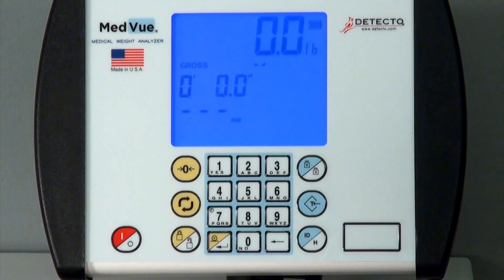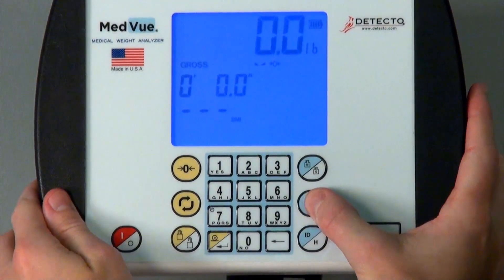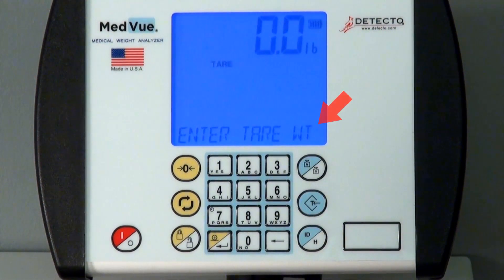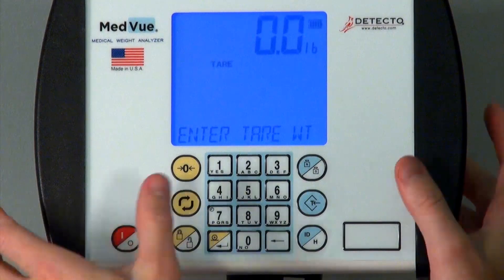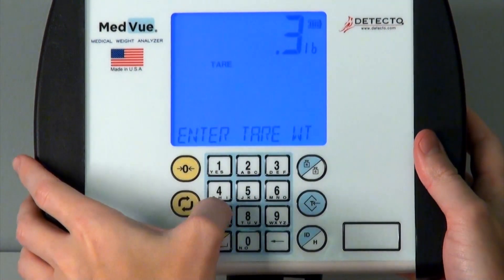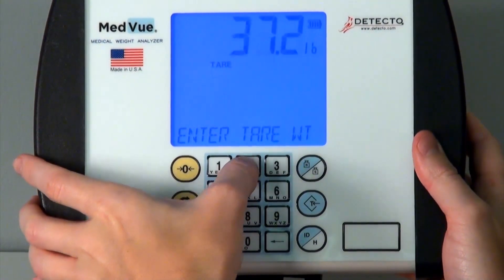When the tare weight of the wheelchair is known, simply press the tare key without any weight on the scale. The display will change to Enter Tare Weight and the tare enunciator will toggle on. From here, use the numeric keys to enter the tare weight and then press Enter.